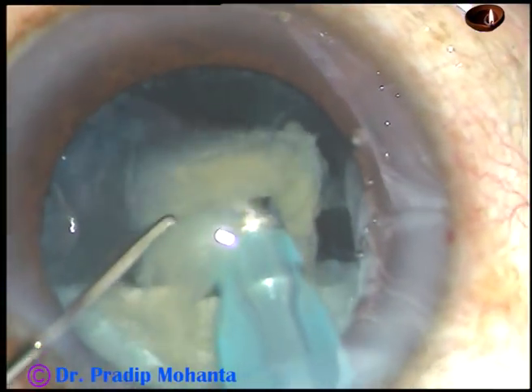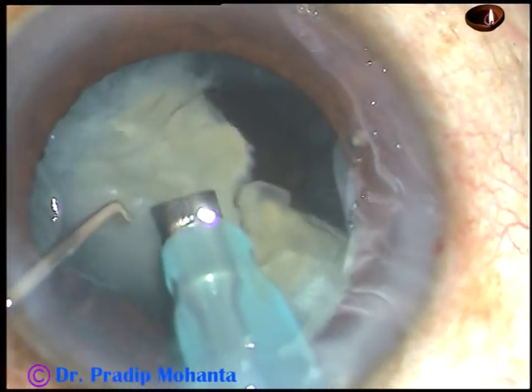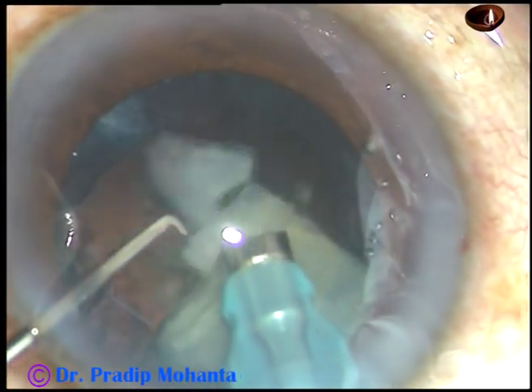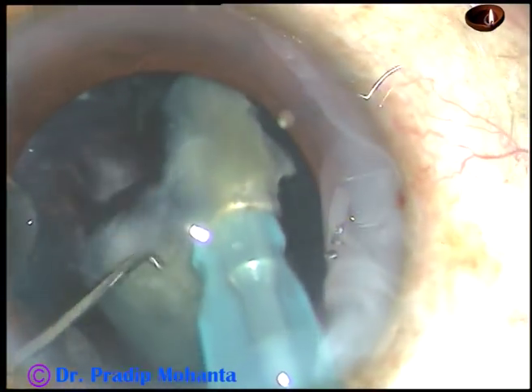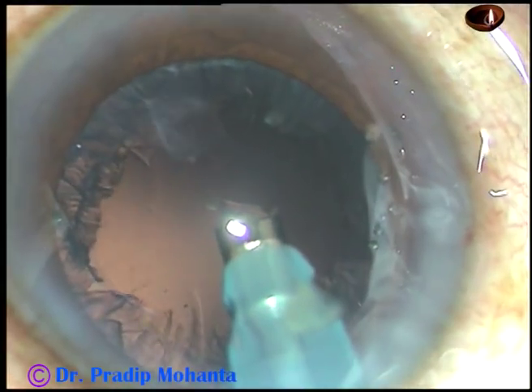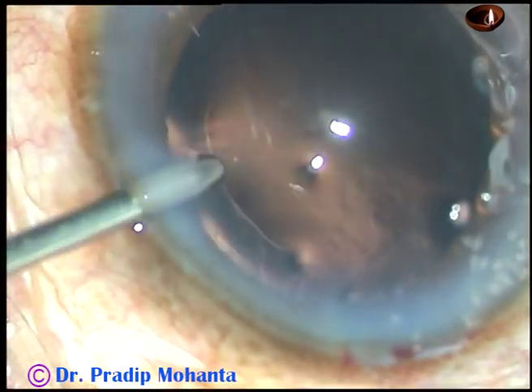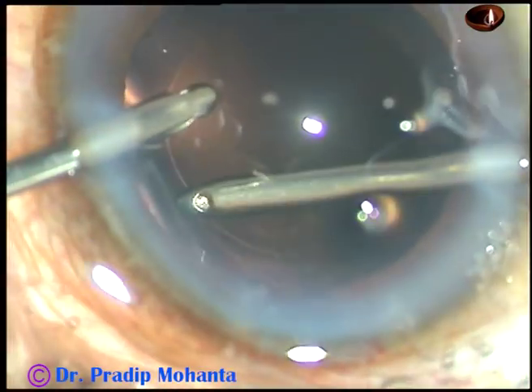In this case, the ultrasonic power is 60%, flow rate is 45 ml per minute, and vacuum is 450 mmHg. The anterior chamber is very stable with no surge. The machine being used is Alcon Centurion. It is a beautiful machine, but every machine is good if you know it — you can do safe surgery with all machines, even the one considered a poor man's machine.